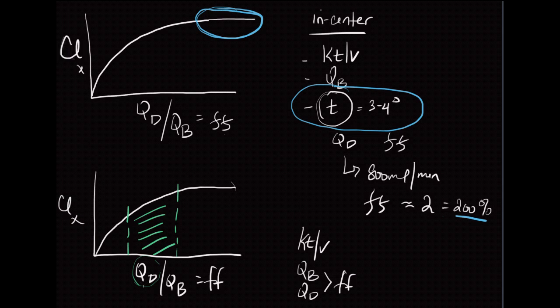flow. Now, it helps that a home hemo patient does not need to achieve the same KT over V as an in-center patient. Home hemo patients need about 0.42 per session. Remember, home hemo patients do anywhere between 5 or 7 sessions a week. In-center patients need a KT over V of 1.4, predominantly because they only do 3 sessions a week. So this higher frequency of dialysis helps the home hemo patient. It helps us in writing our home hemodialysis prescription.